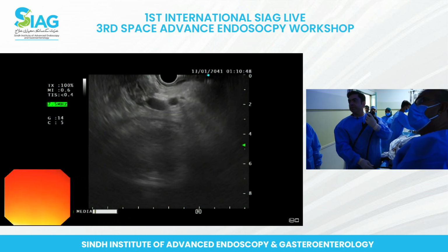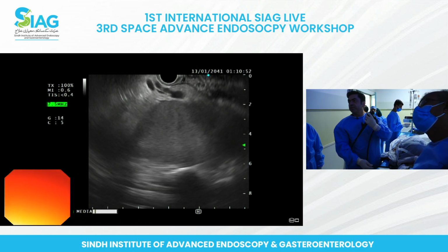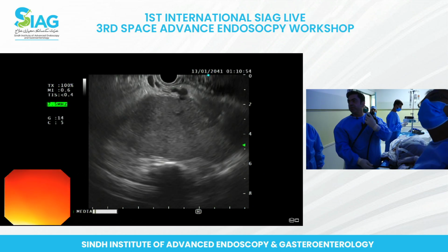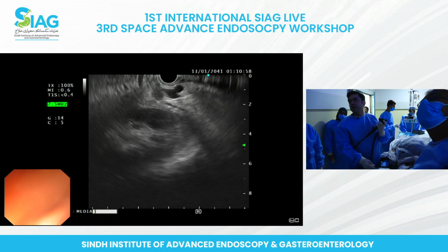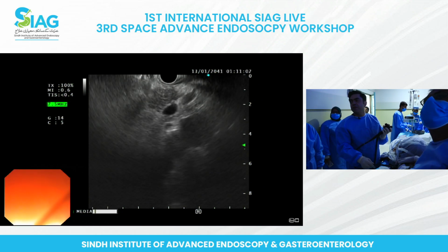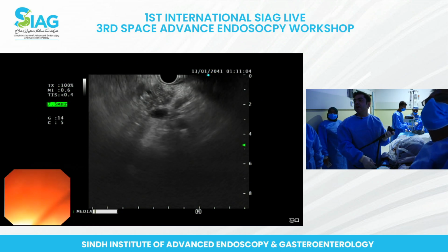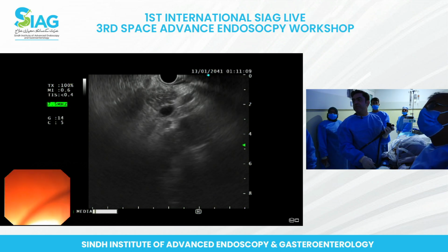When you've had post Whipples or post surgical stomach, looking at the antrum or looking at the distal part or the head of the pancreas, anything you want to mention? So I'm just trying to trace from here. I'm going now towards the neck of the pancreas here.